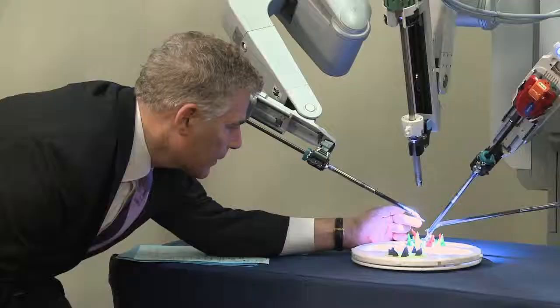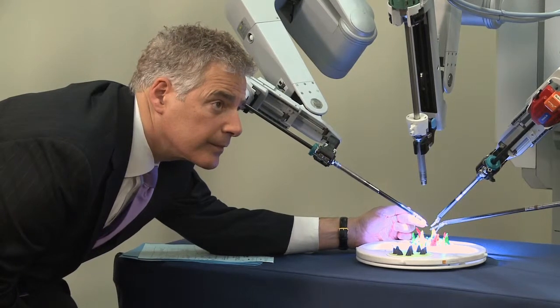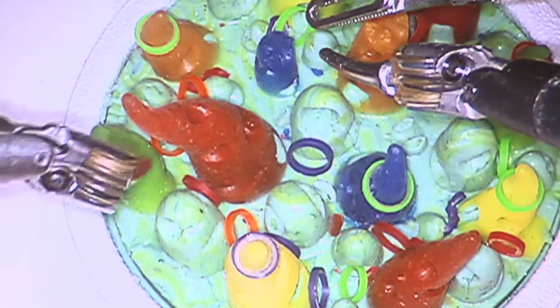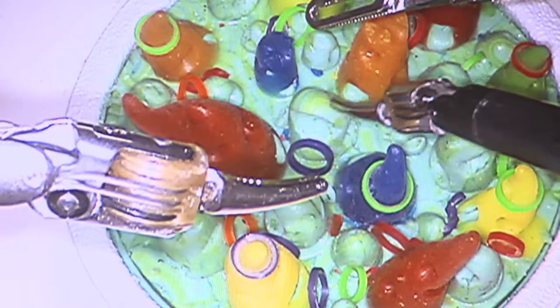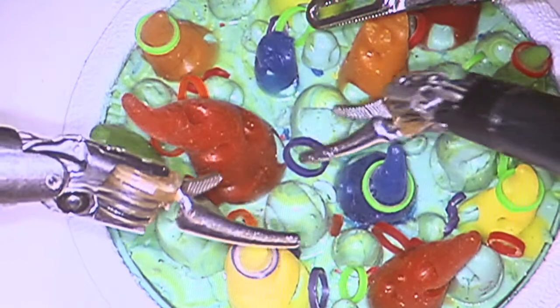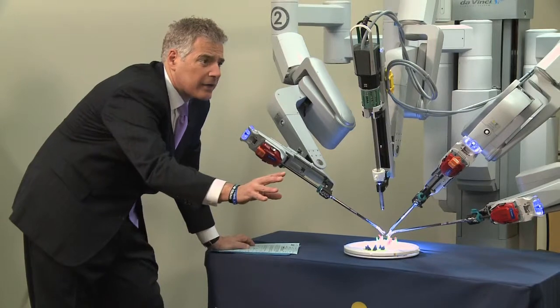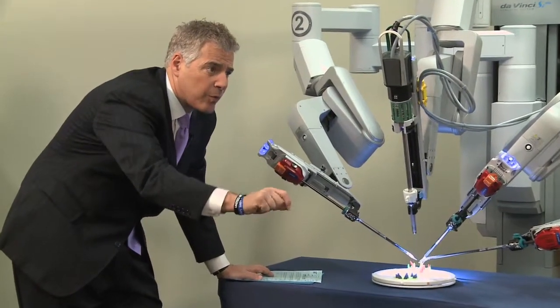That's fascinating. Now, there are several things about the robot which are different from laparoscopic. One is you can readily see how the instrumentation articulates in such a way as my wrist does. And this gives us a much better ability to move into tight spaces, close anatomy, as you can see here, for example, moving things over in this direction. When you have straight laparoscopy, the instrumentation is defined in 2 planes, in and out and sideways. That's it. No wrist? No wrist. So define that again, doctor. So laparoscopic technology, not like this, does not have the wrist capability.